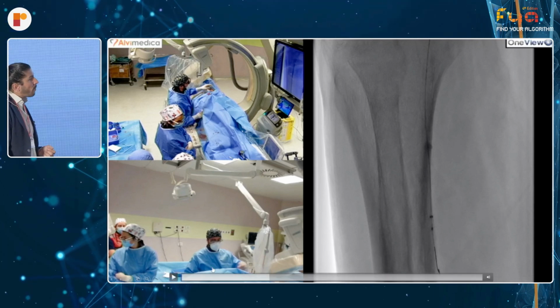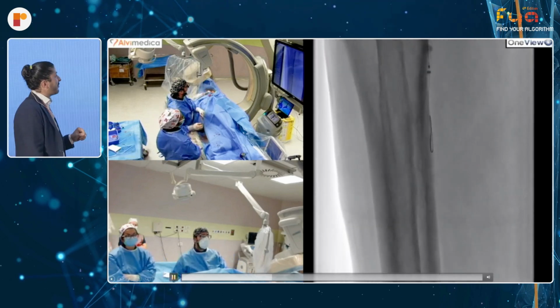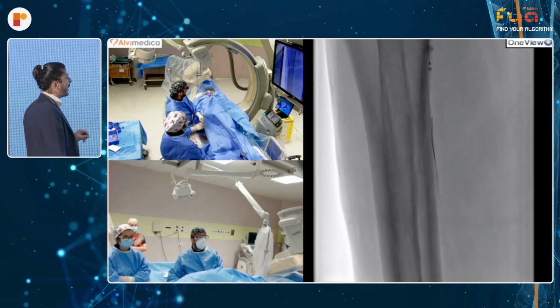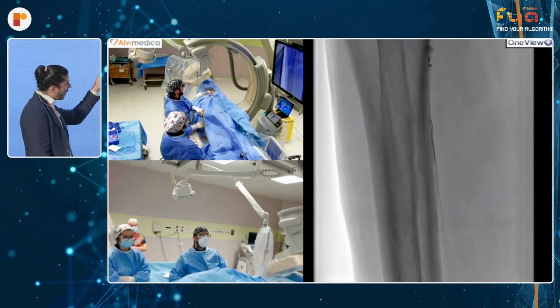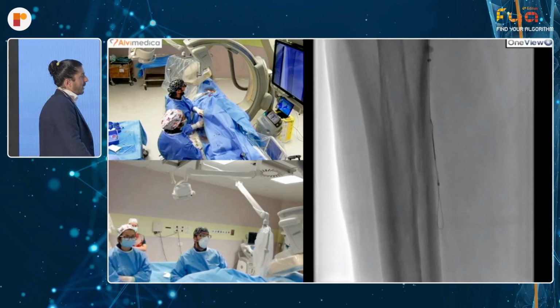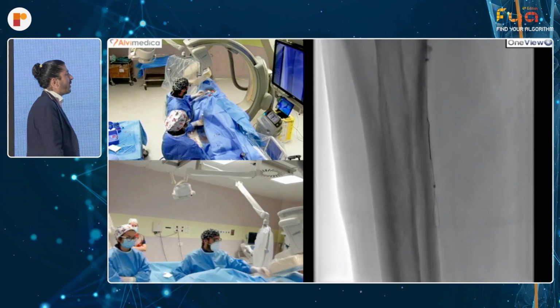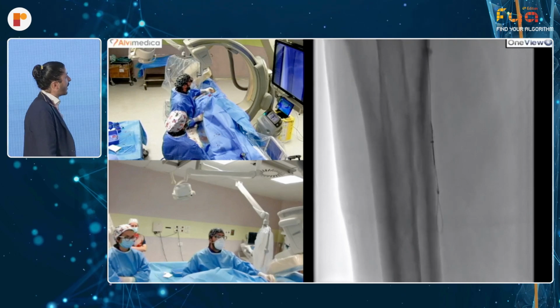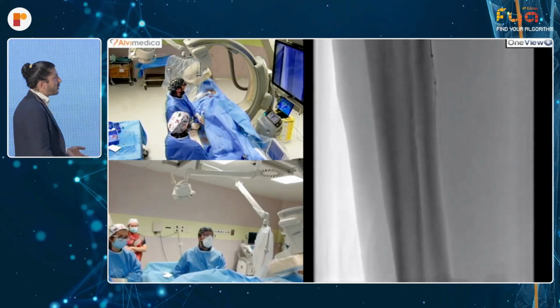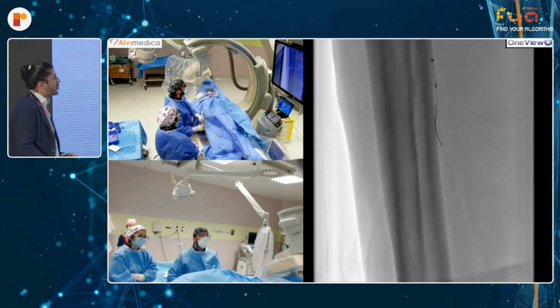We can start the video again. So, the 4 French support catheter, O14 platform device, allowed me to enter in the posterior tibial, allowed me to do the first part endoluminal, and finally, I decided to make the loop with this Terumo Advantage Trac 014 guide wire and go subintimal. Not too much calcium, so it allows us to mix between endoluminal and subintimal progression.